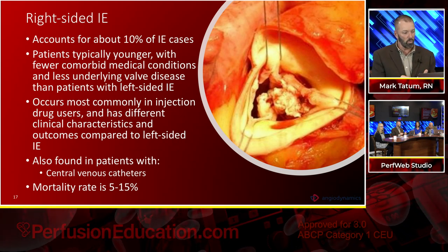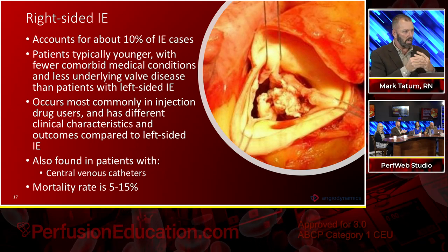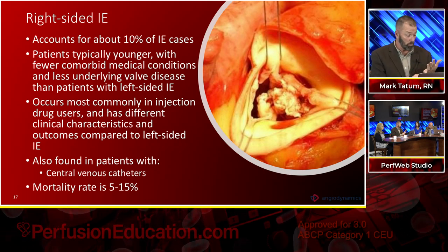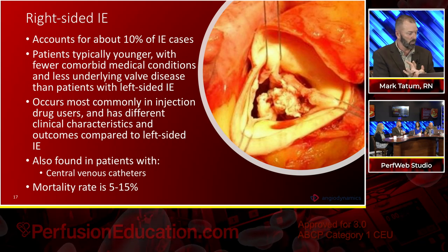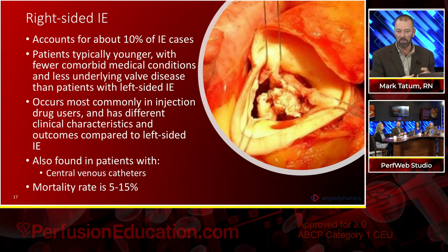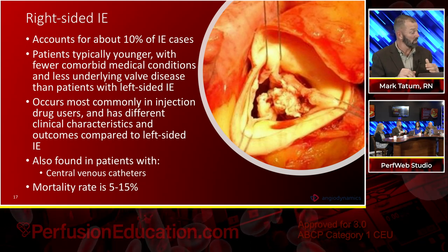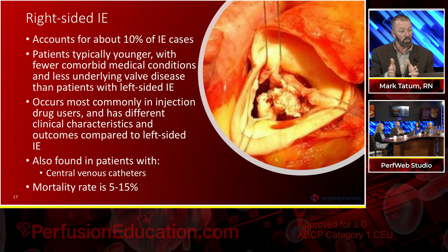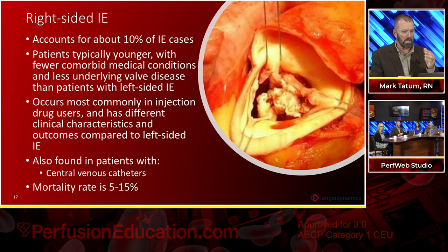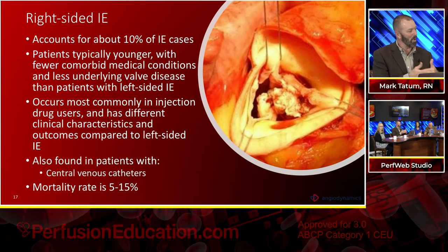we see a couple of things. One, we see in some cases, and this is case specific, not a claim of the device, patients who are septic, on pressors, intubated, and within 24 hours are off pressors, extubated, with significant relief of their sepsis. We see that in some cases. There are other cases where in the short period afterward the sepsis actually worsened for a period of time before it got better. We do see both, but it is more frequent that we see a resolution faster than a worsening of the sepsis prior to resolution.